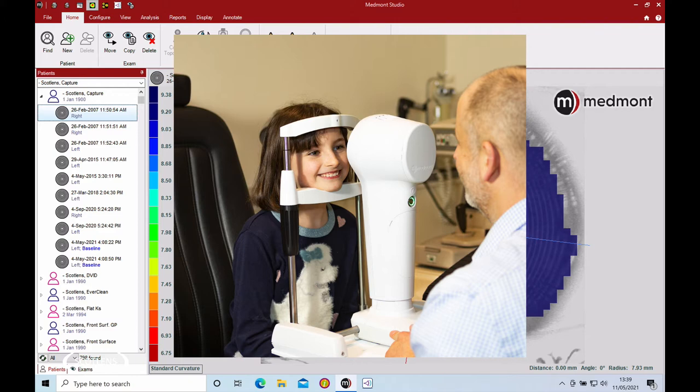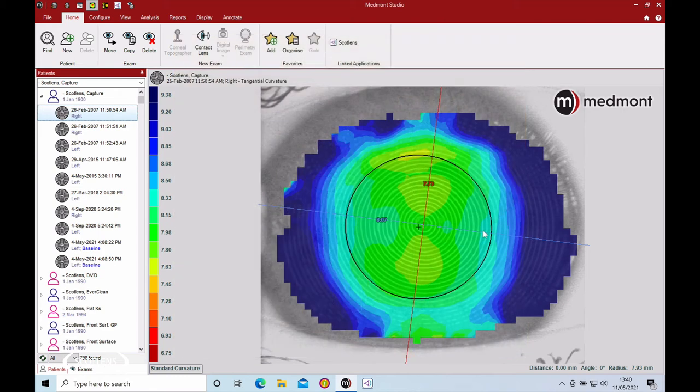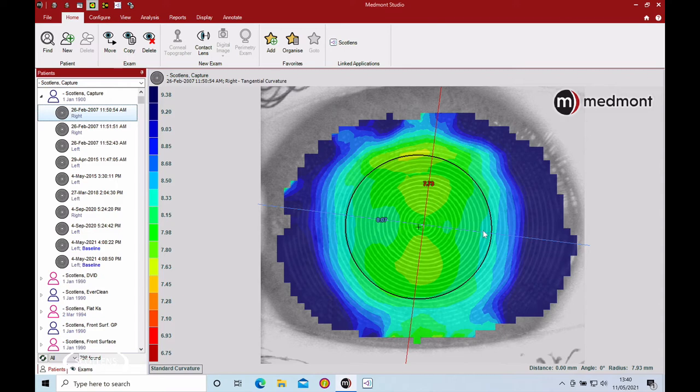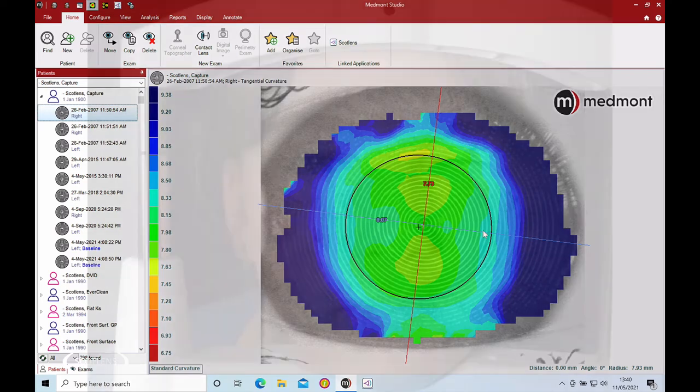Make sure your patient's really comfortable and able to move around. Then instruct the patient with the chin and hand rest, probably turn their head slightly to one side so the eye they're presenting to the topographer is more available to the placido image.